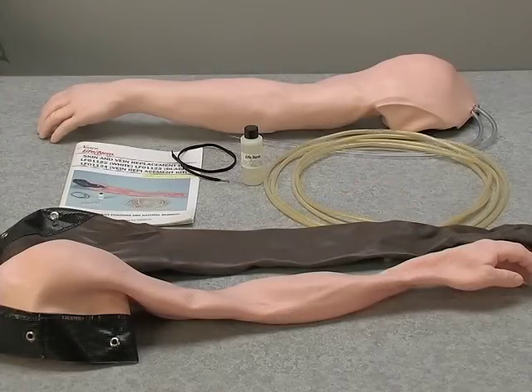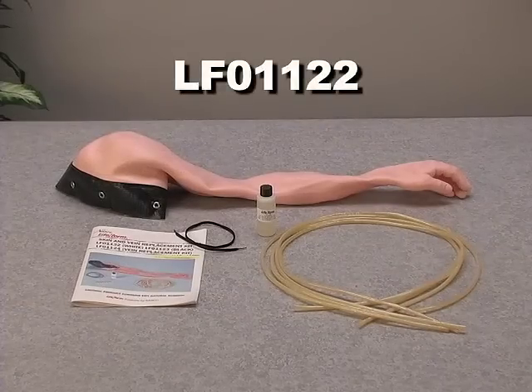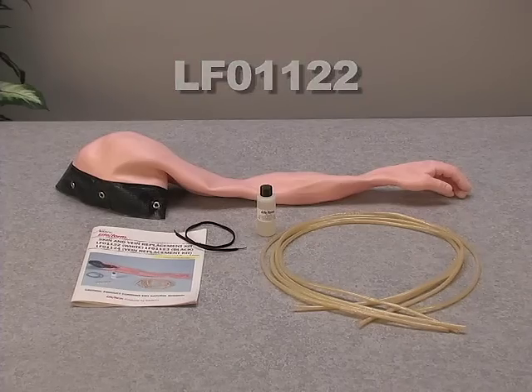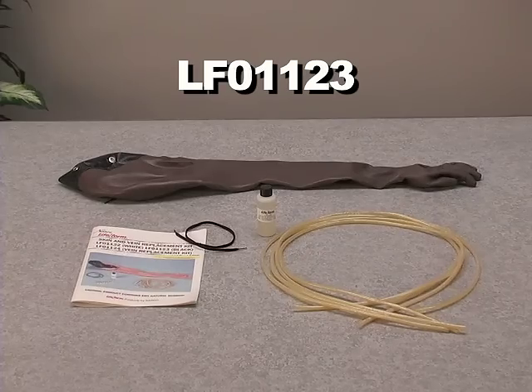There are two options available for purchase: the LF01122 White Skin and Vein Replacement Kit and the LF01123 Black Skin and Vein Replacement Kit.